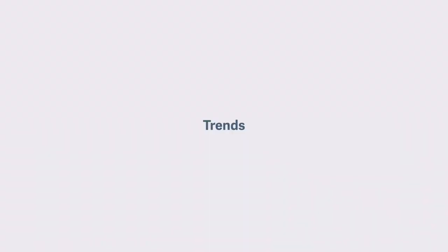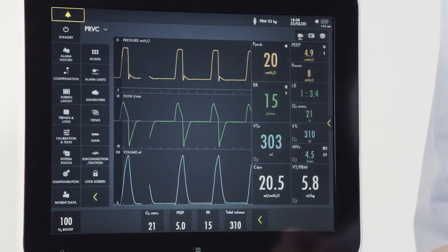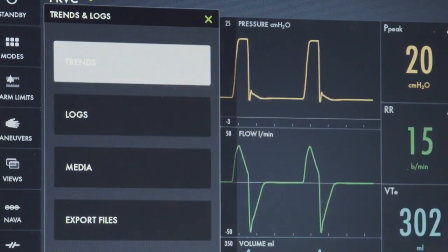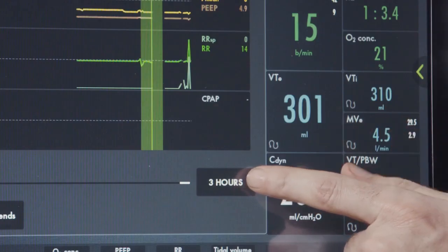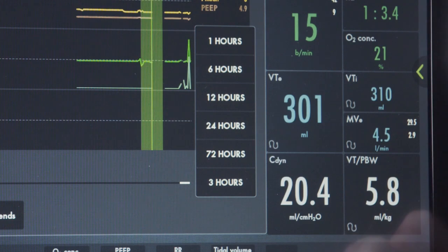To access the trending data, go over to the menu key. By pushing the green arrow, I can see my extended menu functions, among them the trends and logs button. From here, selecting trends will take me to my trending screen. I can set the amount of time of the trended information that I can see — up to a maximum of 72 hours of trended information.